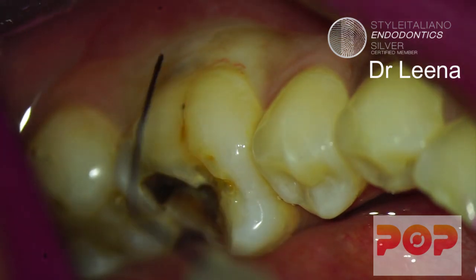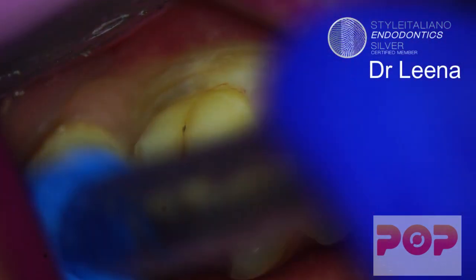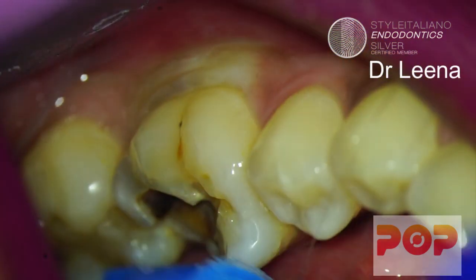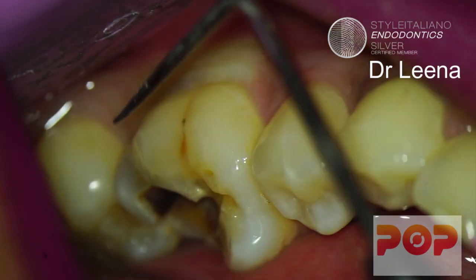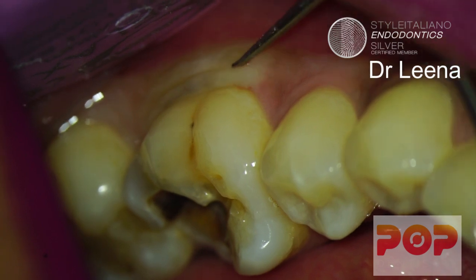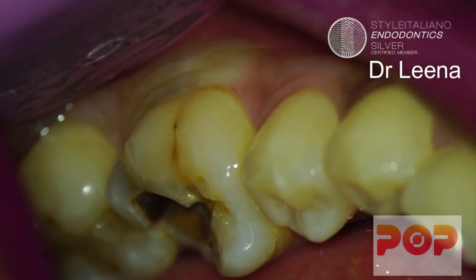The patient is also feeling some pain while giving intraligamentary injections. Extra solution which has gone inside the mouth can be taken with suction. You can see the blanching there. This intraligamentary injection is 100% effective — you can perform a root canal treatment just after this.